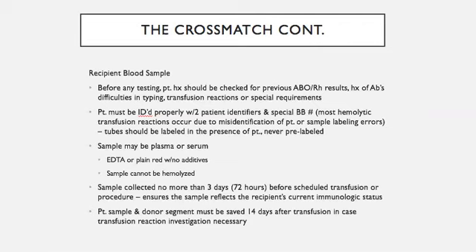The recipient serum or plasma is mixed with the donor red cells. They get centrifuged, and then we're looking for agglutination. So there's no incubation step there. It's just a couple drops of patient, couple drops of donor, spin and read that reaction. There should be no delay in the centrifugation step or in reading the reaction. This can lead to false negative results, and you might miss an ABO incompatibility.